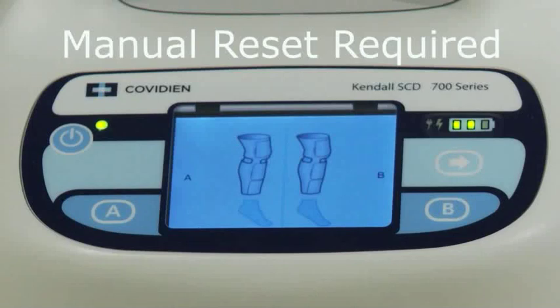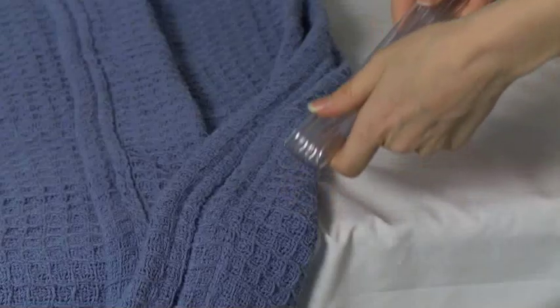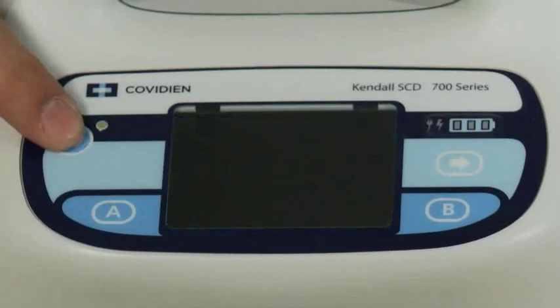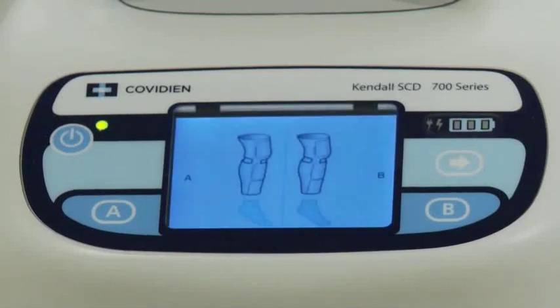An alarm indicating a manual reset is required can be resolved by the user but requires the unit to be powered off and then back on once the issue is addressed. In this example, a pressure alarm due to tube kinking on the A side is shown, along with a red triangle and exclamation point alarm code. To address this problem: step one, identify the location of the tubing kink; step two, fix the kinked tubing; step three, power the controller off and then back on to continue the patient's therapy.